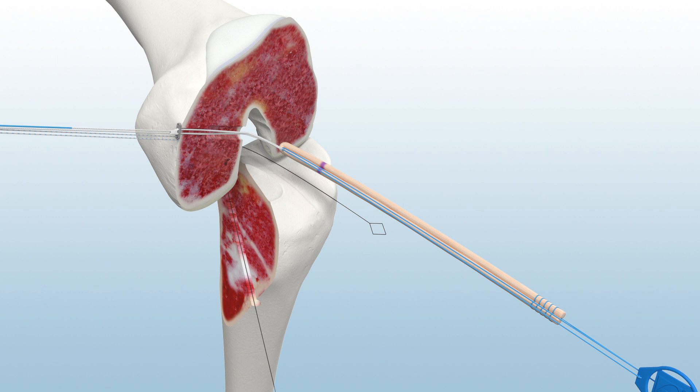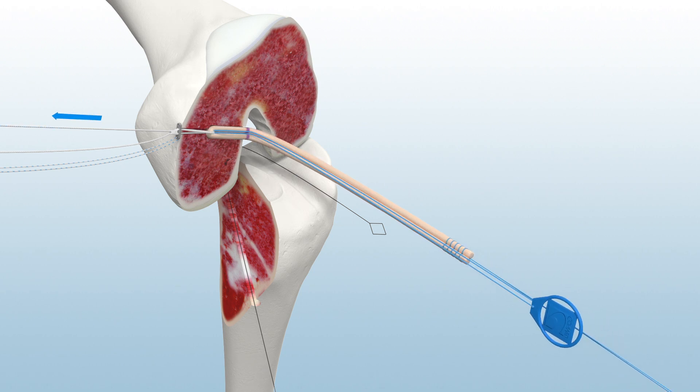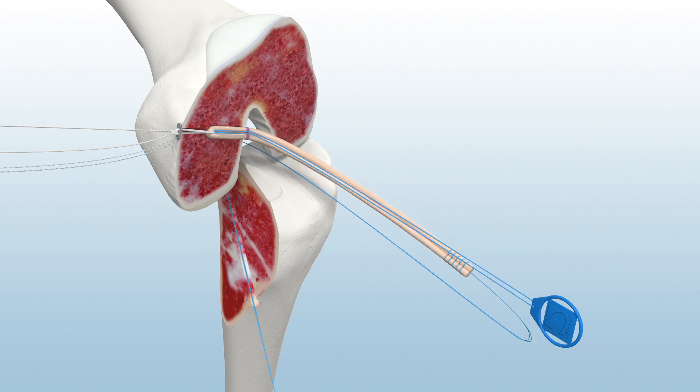To tension the graft loop, drop the lead sutures and pull only the tensioning suture with the blue suture tag while simultaneously applying distal tension on the graft construct. If graft placement optimization is needed, use the Infinity Reversible Button tab to adjust the position of the graft within the tunnel. For tibial graft passage, load the tails of the graft and retrieve through the tibial tunnel.